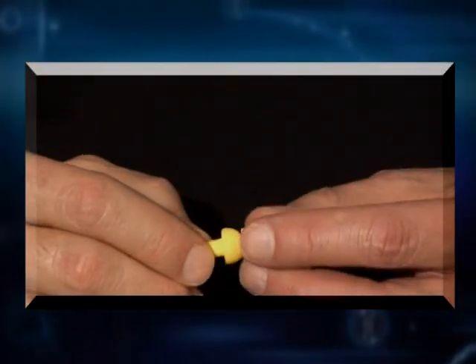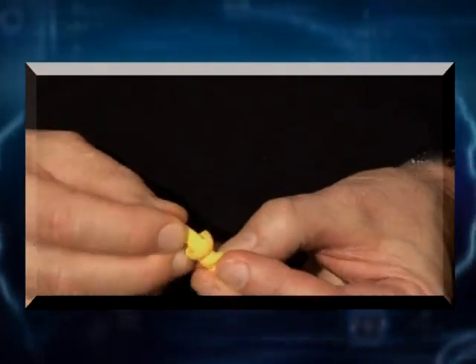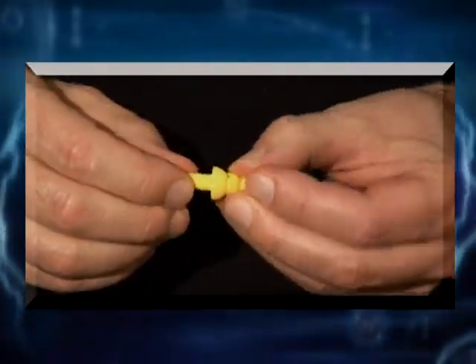One more thing, UltraFit earplugs are durable, but they do wear out. Check your plugs to make sure that they are still soft and pliable, that the flanges aren't cracked or separated at all from the stem of the earplug. If you see any of these problems, get a new pair.